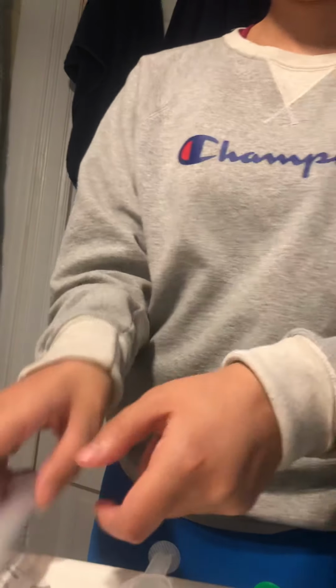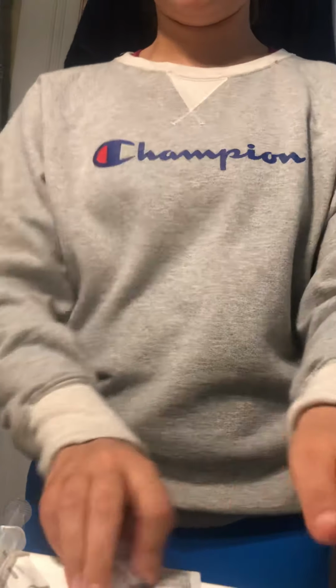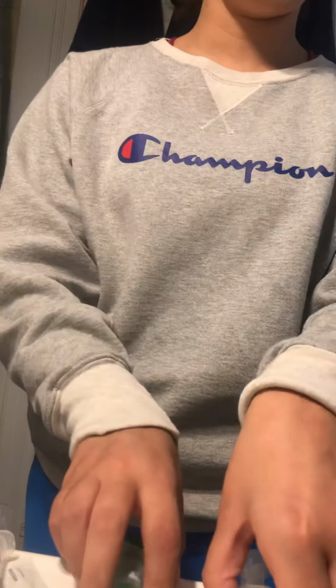Okay, so we're going to take out our normal saline. We're going to make sure we have no air bubbles. Flick, make sure there's no air bubbles. We're going to set it up by having normal saline, then our Lasix, and then another normal saline bottle. So it's all set up for us.